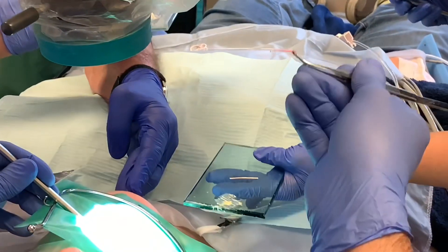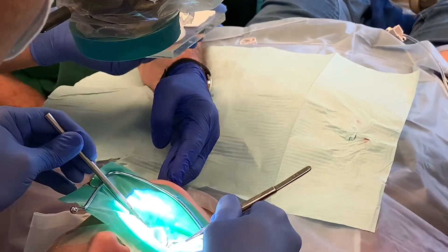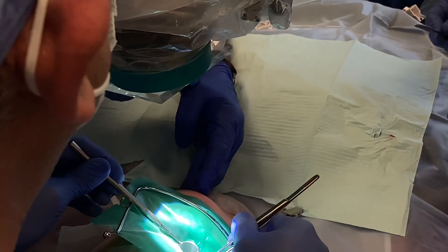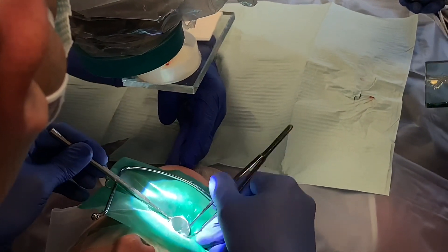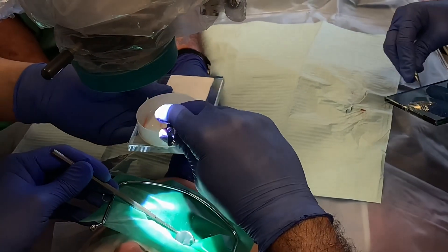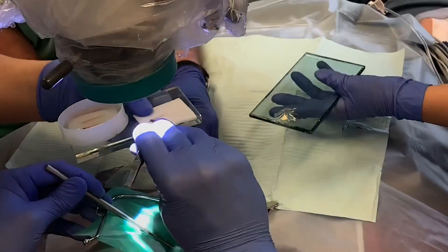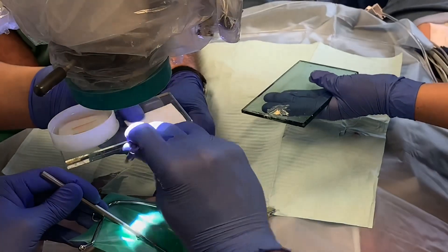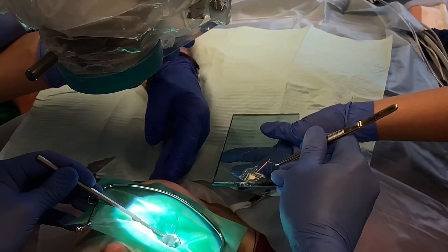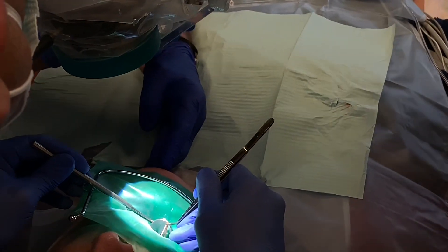I dip my gutta-percha points in sealer and slowly, gently insert each one into the canal — one or two at a time depending on how much room I have in the pulp chamber. I dry the gutta-percha points on a sterile gauze before insertion.